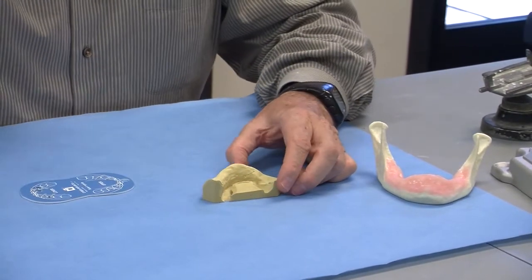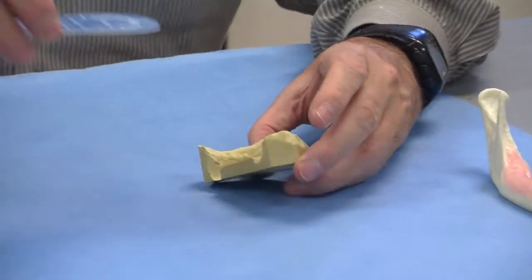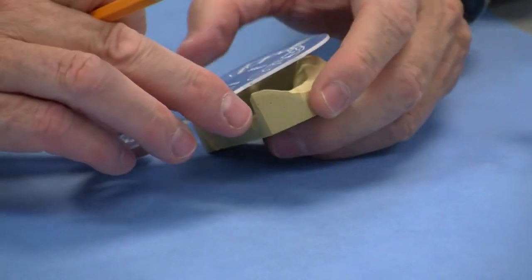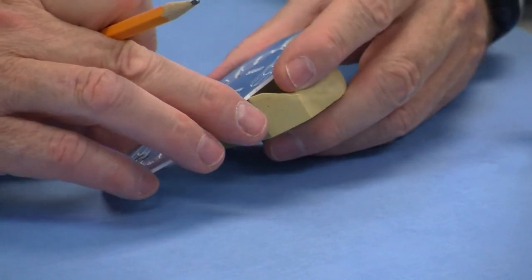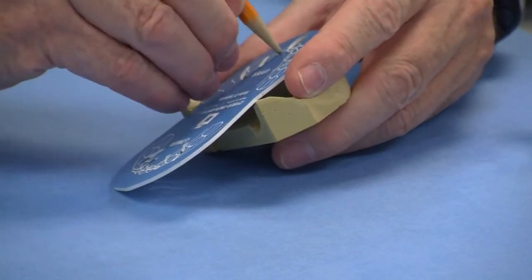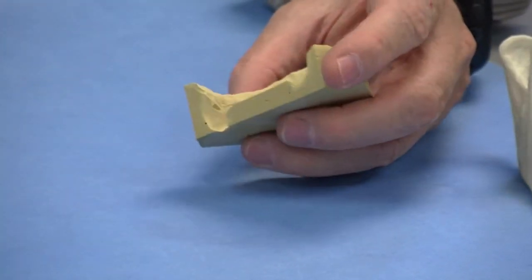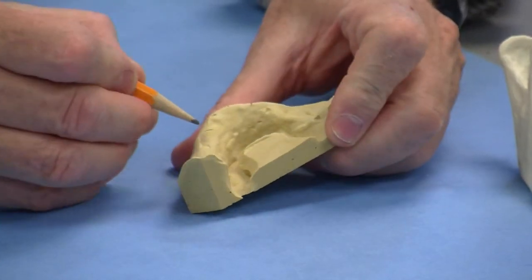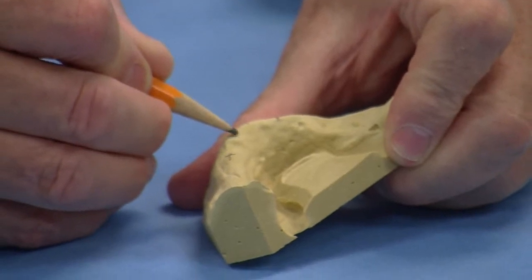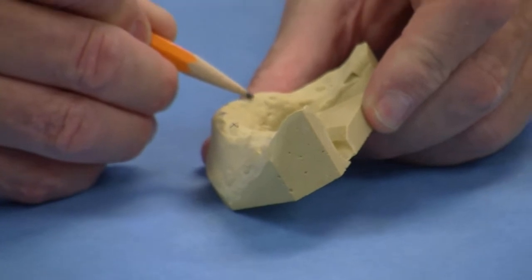We are going to determine the midline first, and when we have the midline, we look at it through the window here, and then we can apply the mark with a pencil, so we have the ridge marked with the ideal location of the 4 implants.